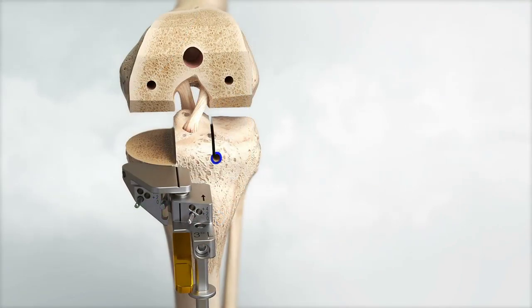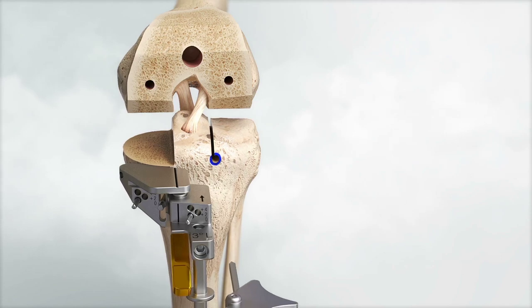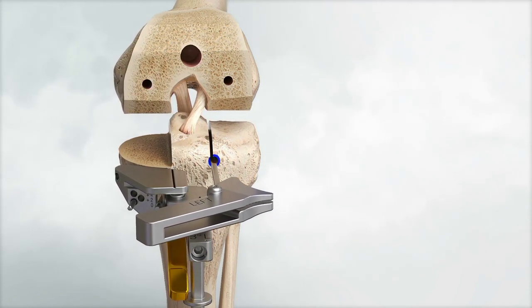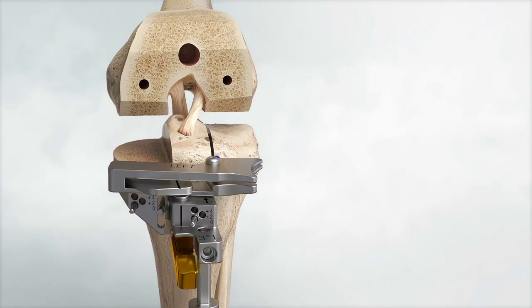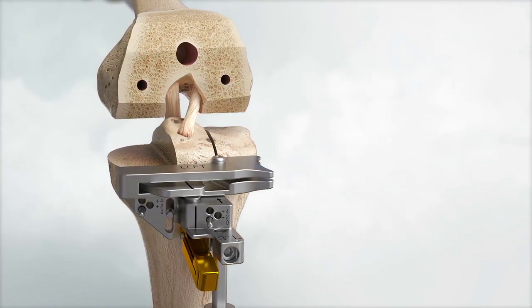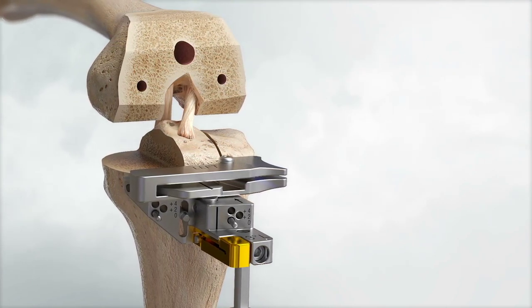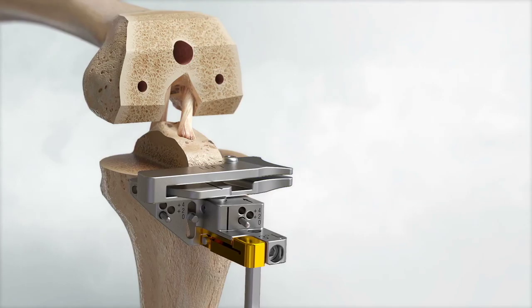Locate the lateral eminence pinhole. Press the floating pin of the lateral saw capture block into the hole while slotting the posterior tip of the saw capture behind the patellar tendon. Attach the lateral saw capture block to the datum block. Adjust the lateral saw capture for optimal fit against the lateral anterior tibia and under the patellar ligament and lock using the datum block. Resect the lateral tibia using a narrow oscillating saw blade.